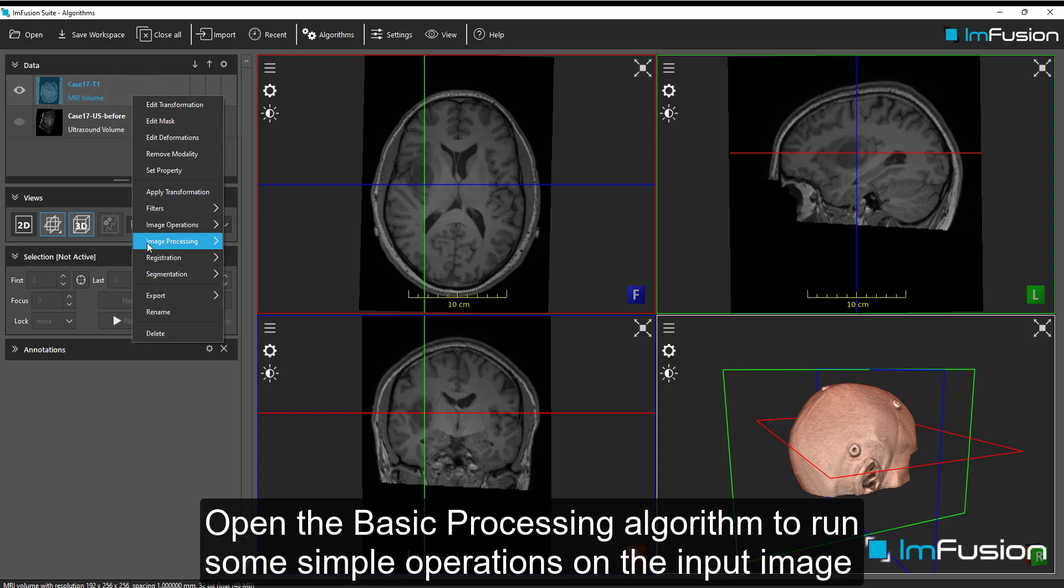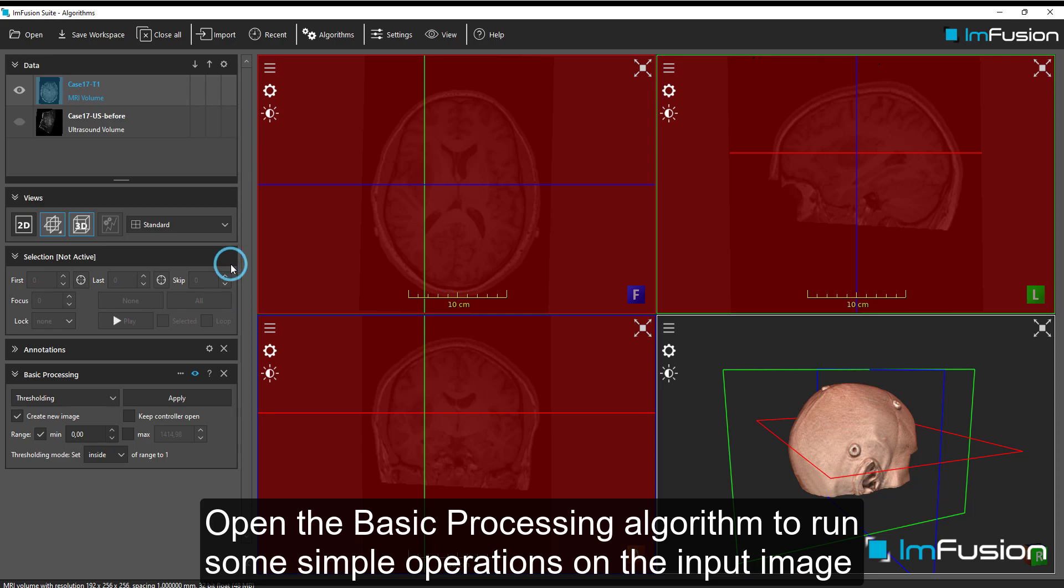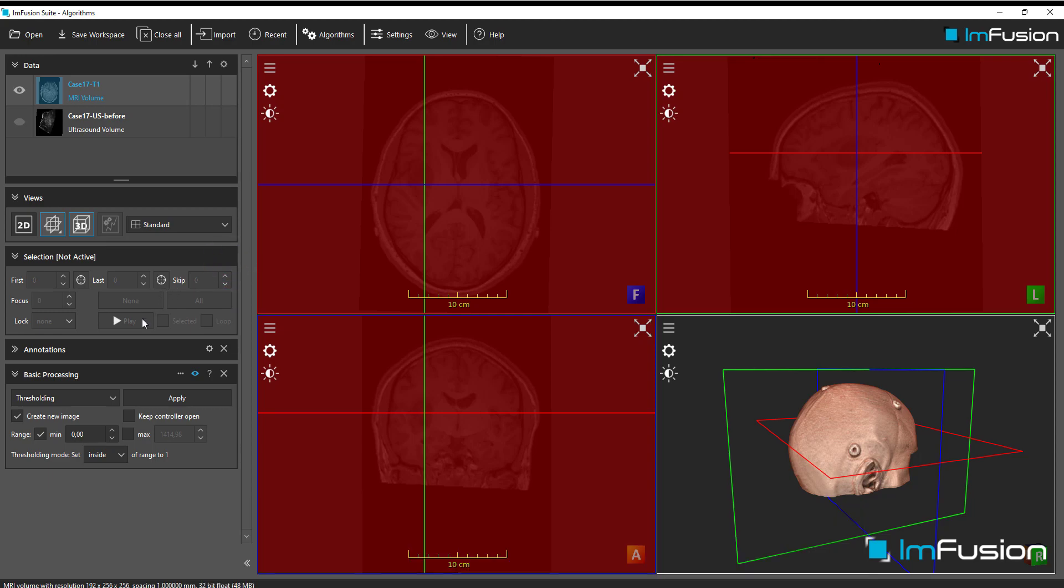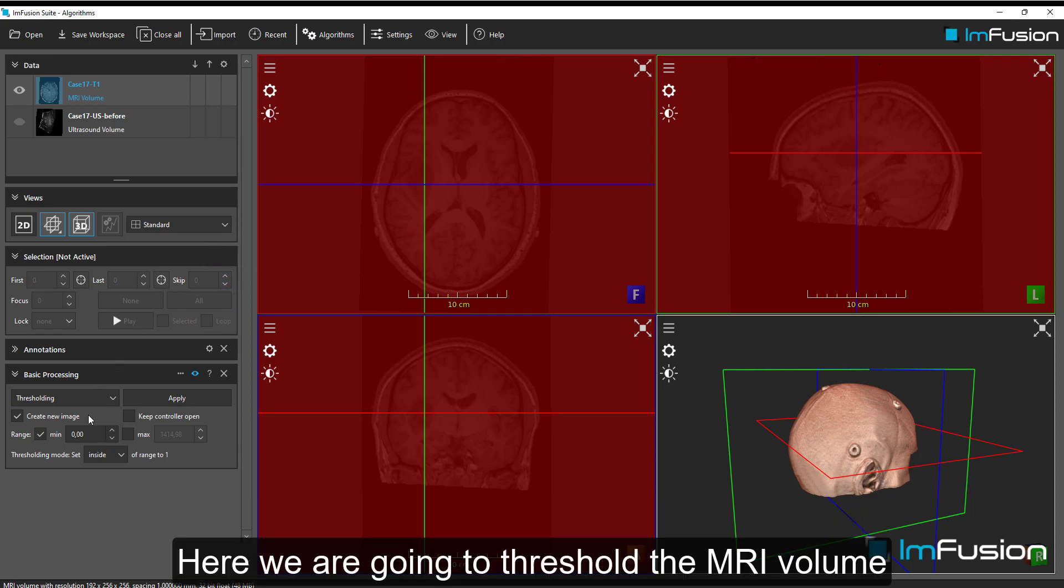Open the basic processing algorithm to run some simple operations on the input image. Here we are going to threshold the MRI volume.